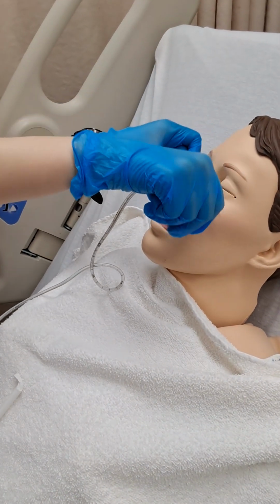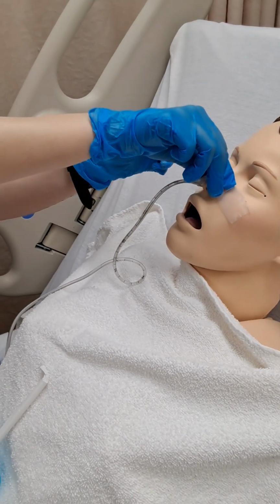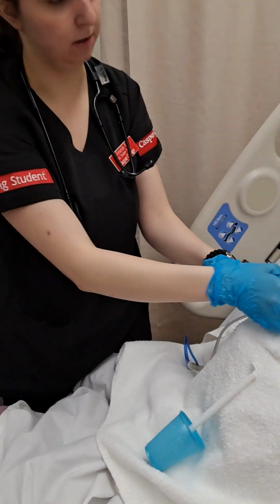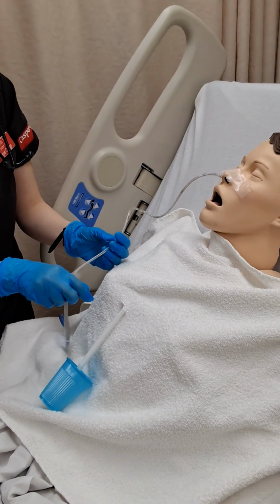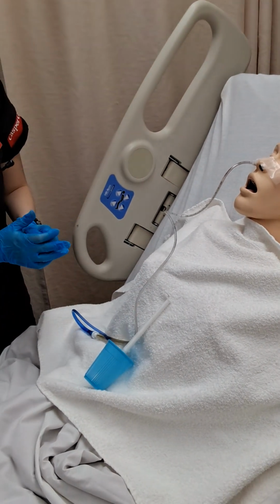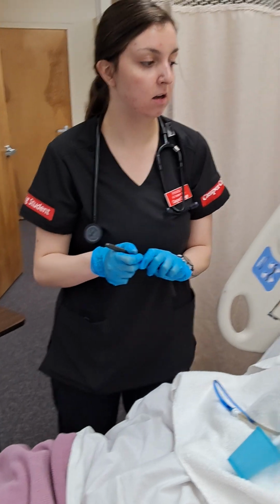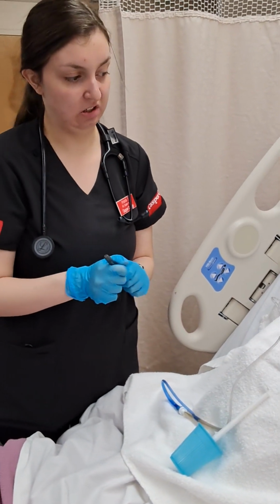Okay. He did not become cyanotic or excessively gag, so I advanced the tubing further. I'd reassure him if he had excessive gagging, and I would stop.